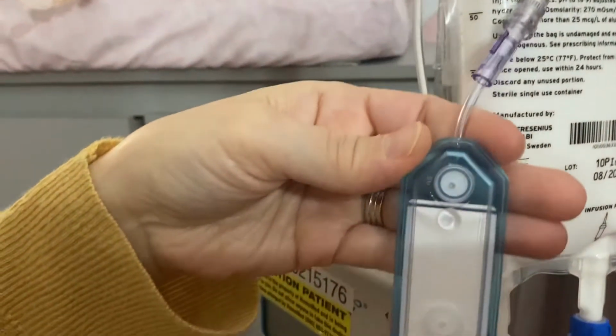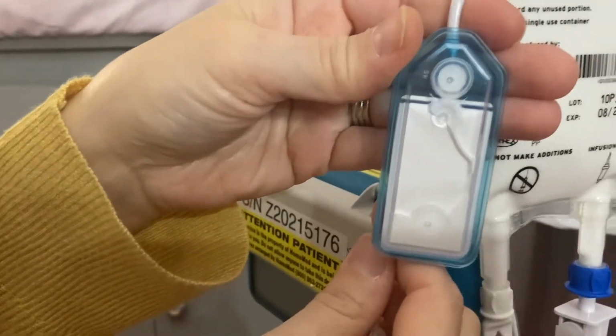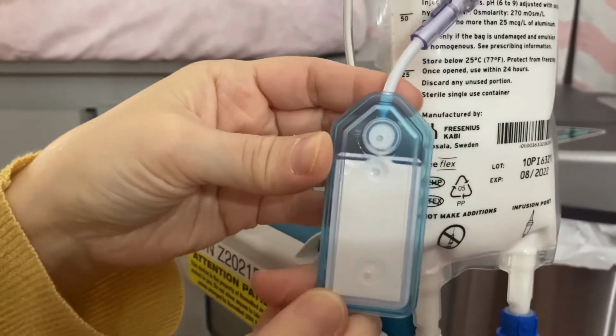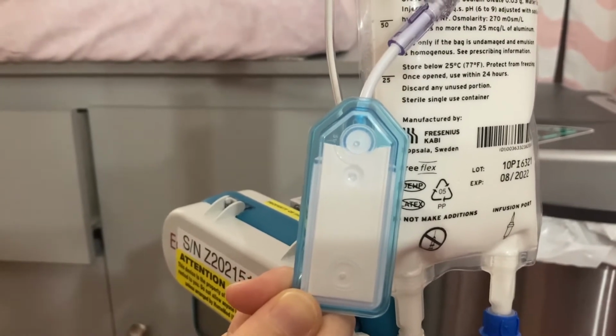When it gets to the filter, it will fill up in the front and then fill in the back before finishing in the last bit of tubing. As said before, make sure the filter stays right side up until it is filled with lipids. After that, it does not have to stay in any certain position.